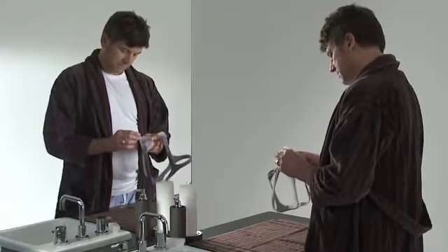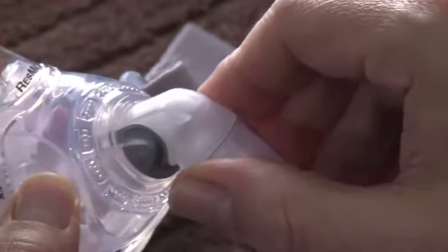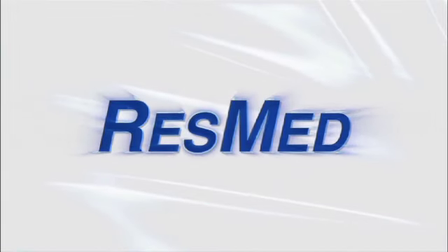Replace the elbow by pressing the side tabs and pushing into the mask. Your mask is now fully reassembled and ready for your next night of restful sleep.